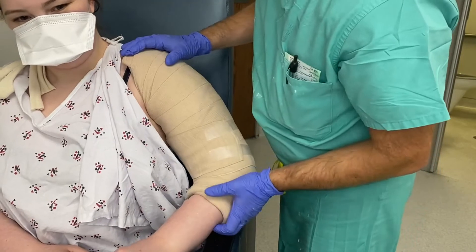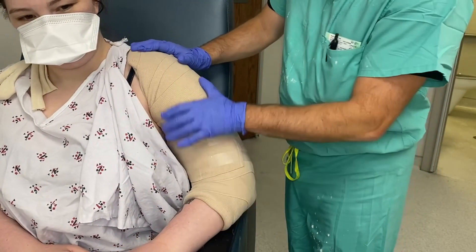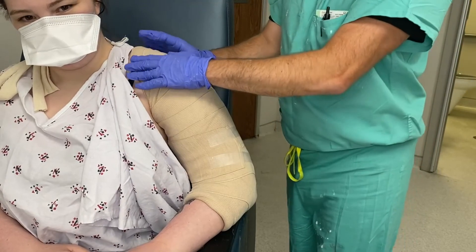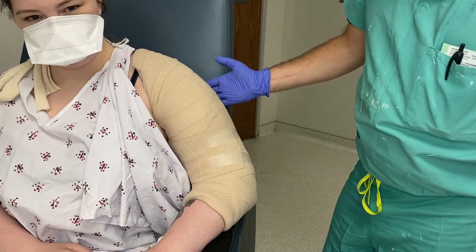Notice, as you can see, it's already shrunk an inch, but that's okay. Like I said, we went all the way up to the neck and that's the reason we went that high. And that is the coaptation splint. This is the conclusion of this video and thank you for your time.